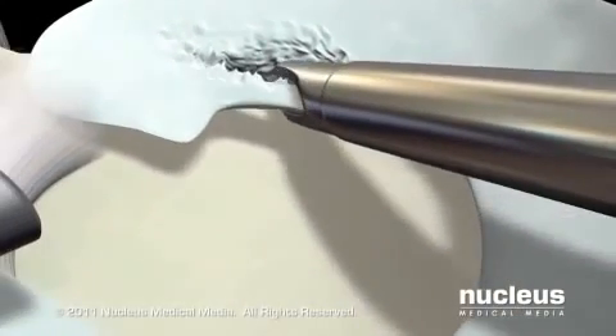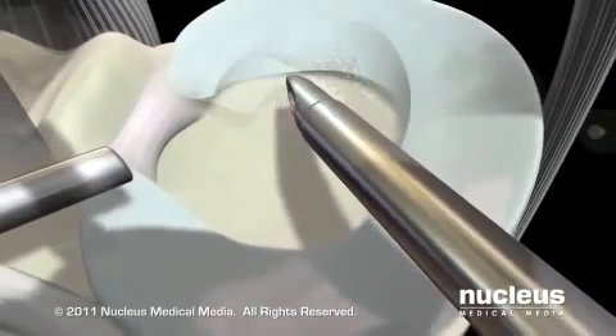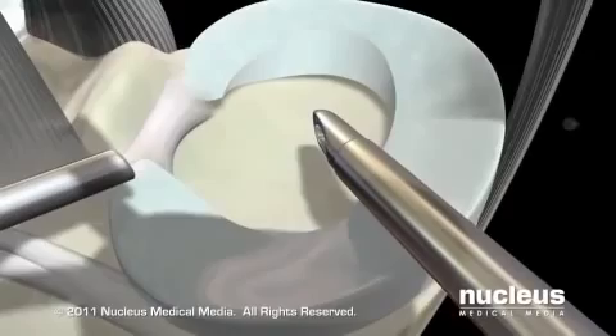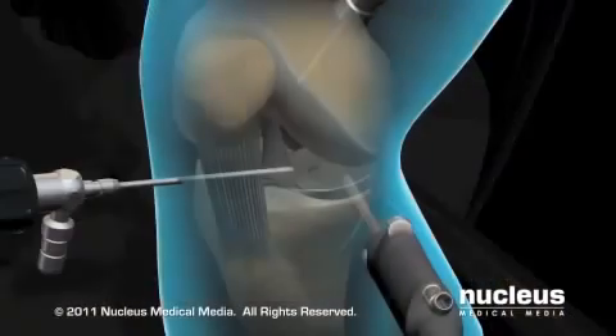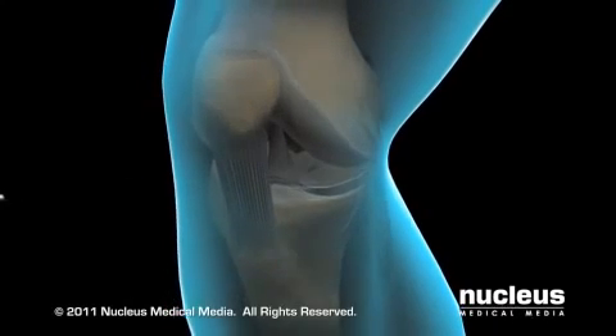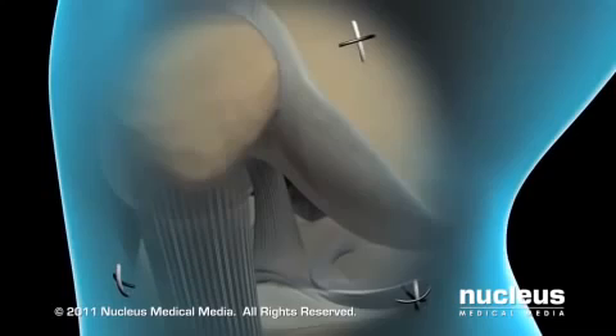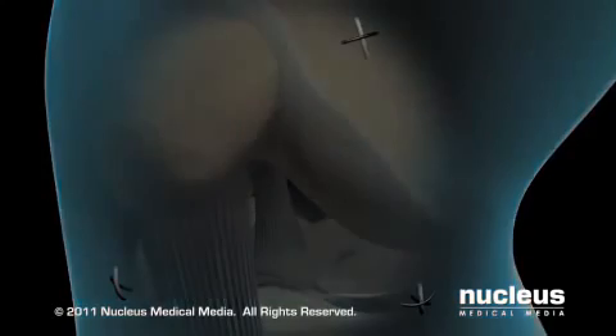While it may be possible to repair the meniscus with small stitches, in most cases the damaged portion must be removed. At the end of the procedure, your surgeon will again carefully examine the entire knee for any areas of bleeding or other damage, remove the arthroscope and other instruments, and close each of the keyhole incisions with a few sutures.